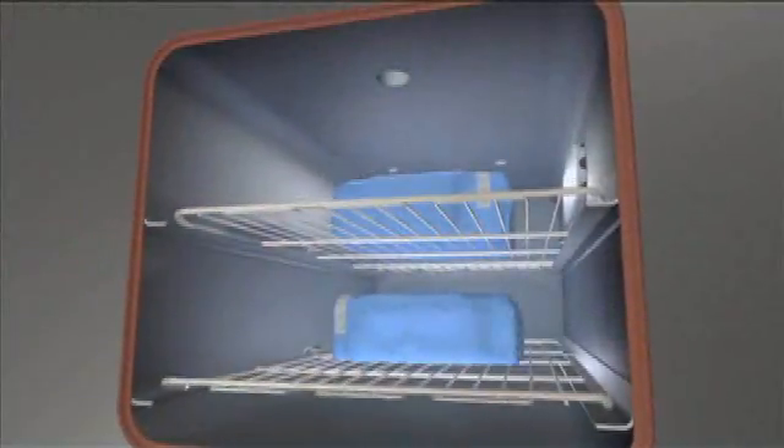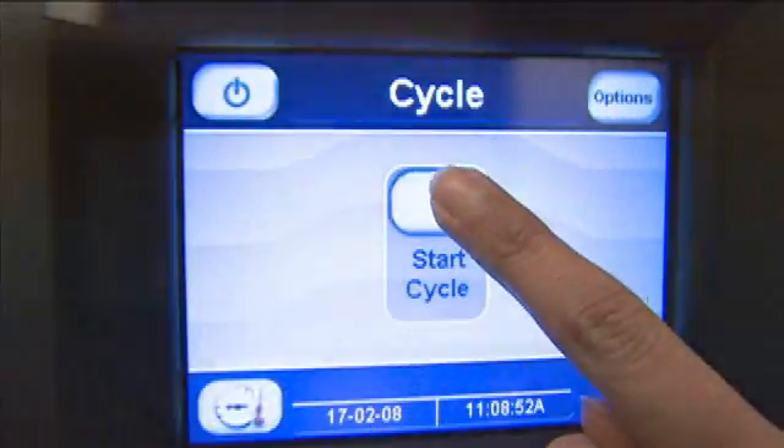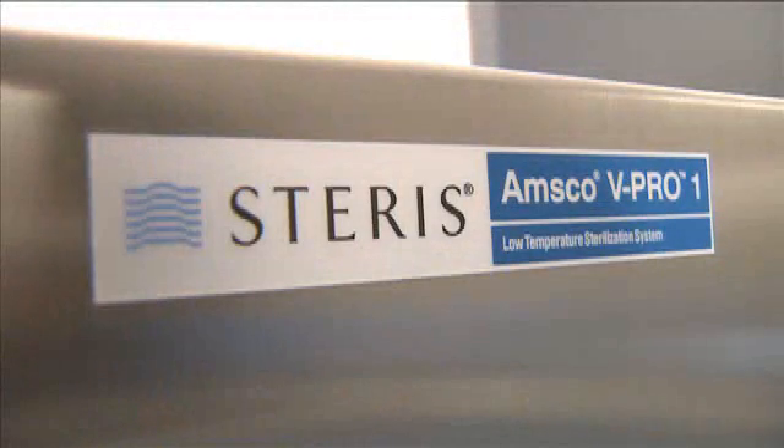The AMSCO V-PRO-1 from Steris. Helping you simplify your life in today's hectic healthcare environment.